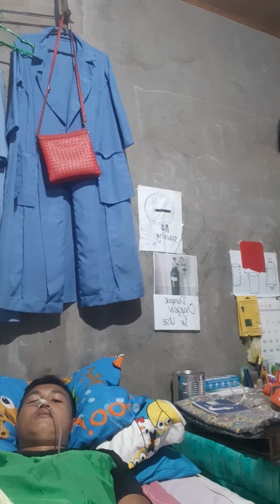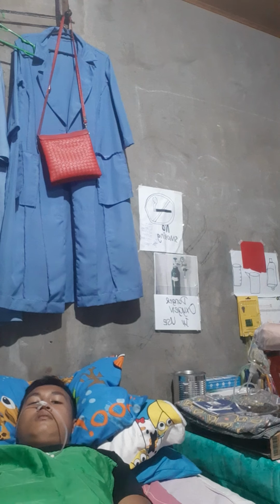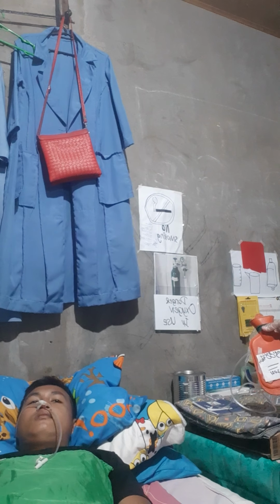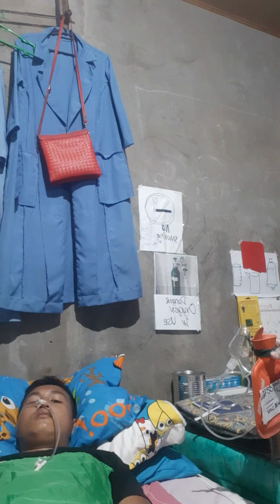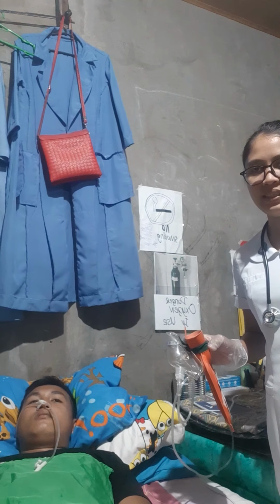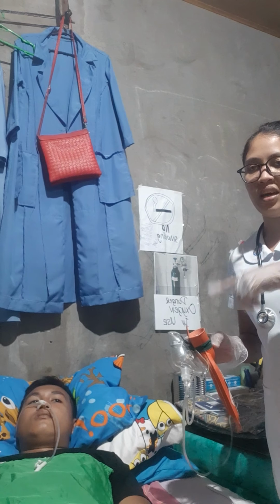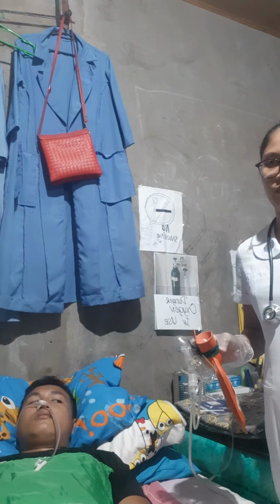So we have to clean it. This minimizes the risk of contaminants entering the feeding. So we need to clean it.